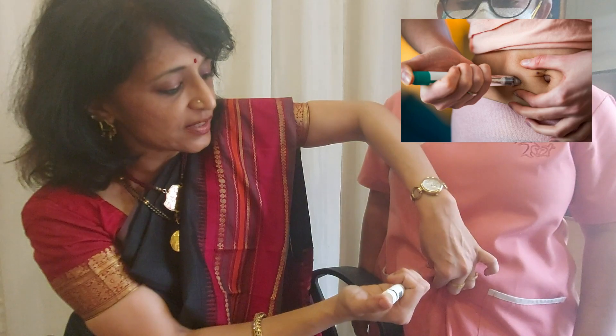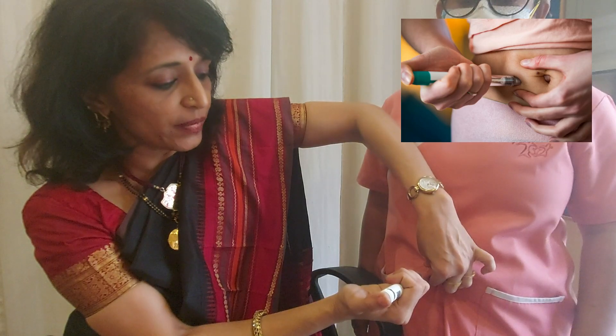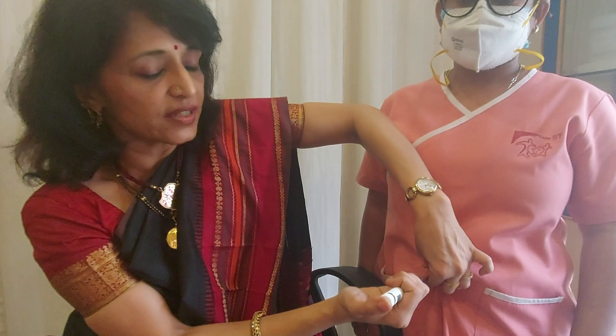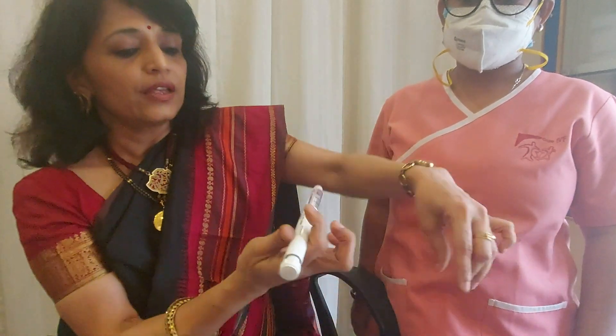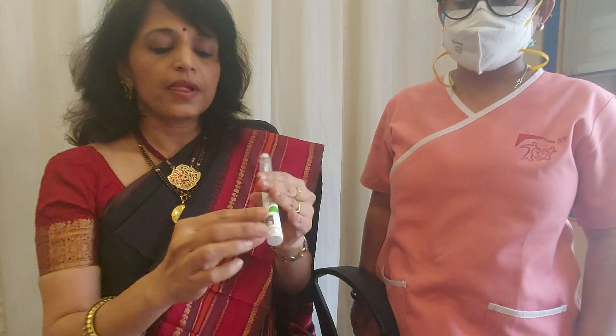Once you've pinched the skin, the needle goes in straight, you wait for a few seconds, and you push the knob in. After you've done that, wait for a few seconds — do not pull out the needle immediately — and then you need to turn the knob and close it.